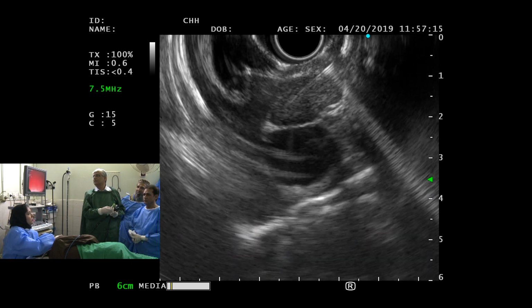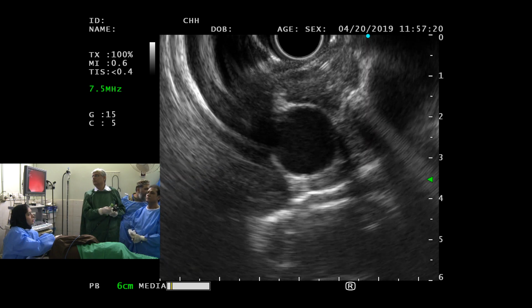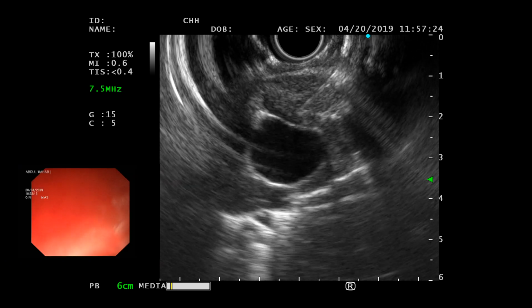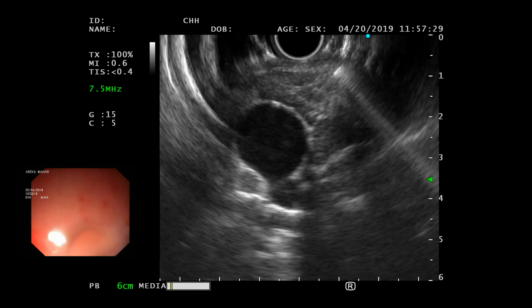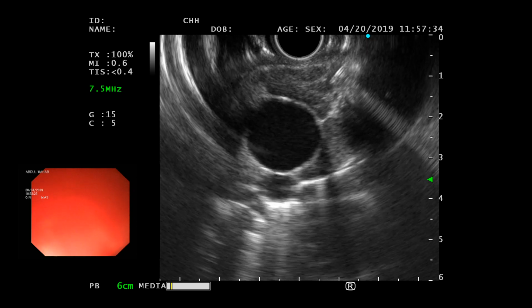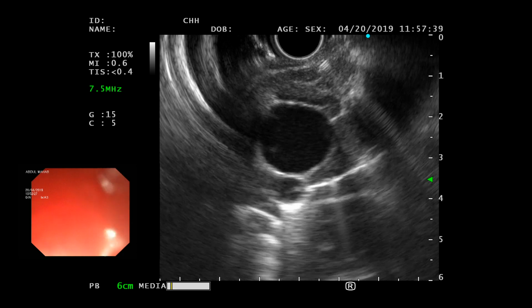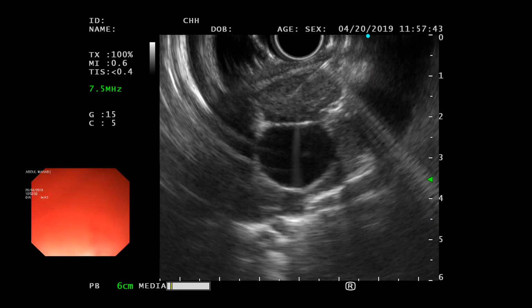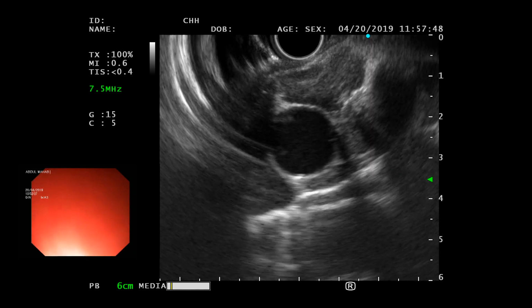Right there. Good. Going in, probably a little bit of angulation. And you can see that the needle faces the tissue perpendicular and is cutting the tissue. It was sliding, it stops and then moves. That was a very good biopsy. So you're just tenting the artery. If it goes onto the artery, you're just tenting. That's it.